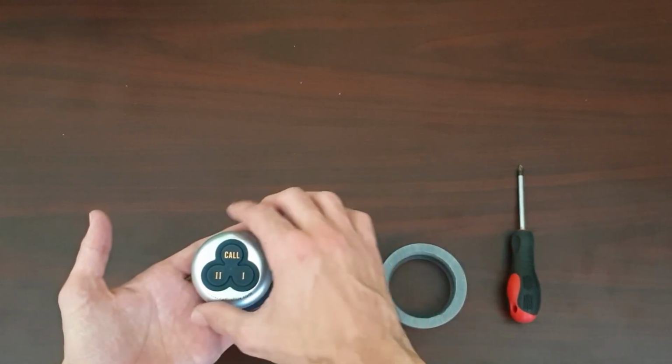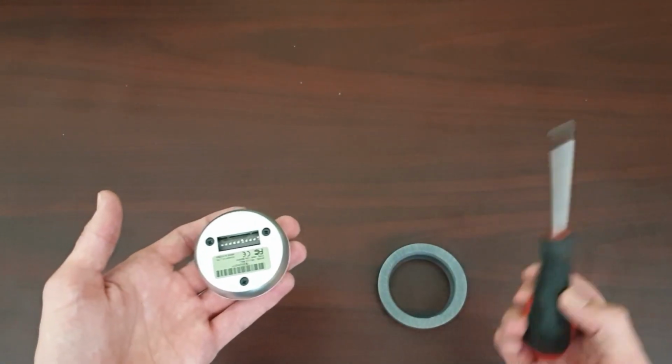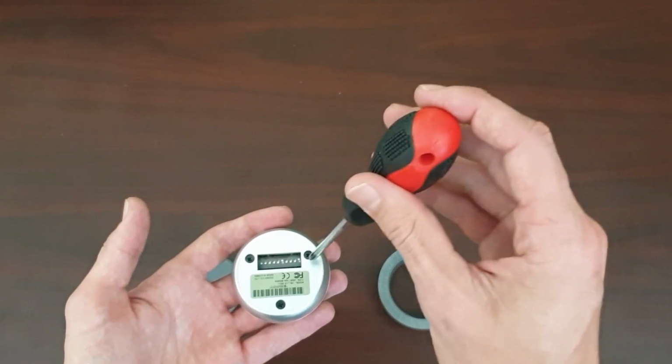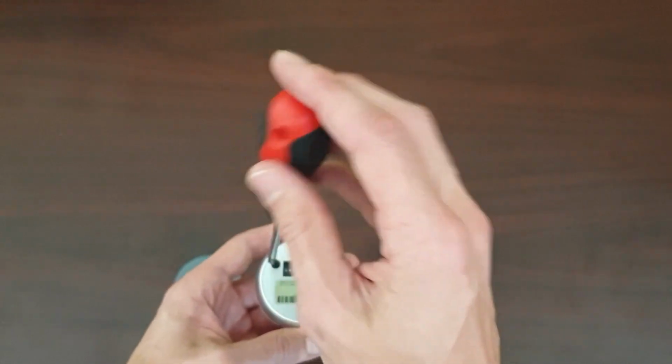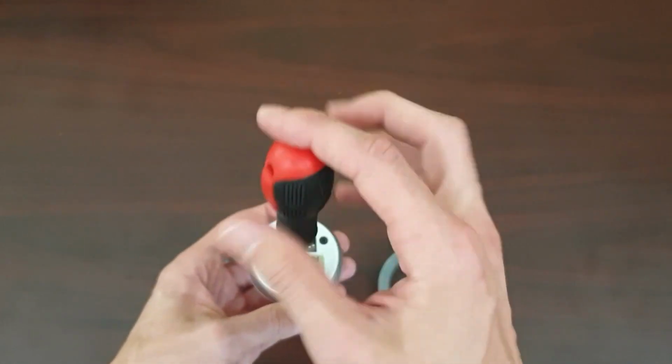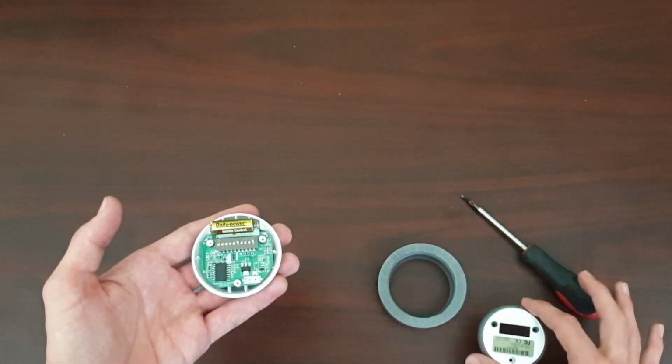Once the holder is unscrewed, you can then take the button out. You'll need a star screwdriver to remove all 3 screws. Once the screws are loose, you can then take the top and bottom cover apart. It comes off as simple as that.